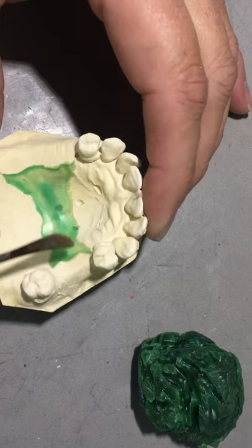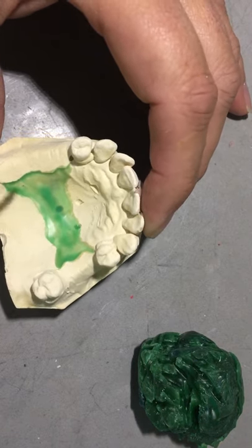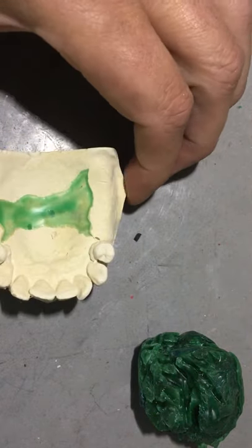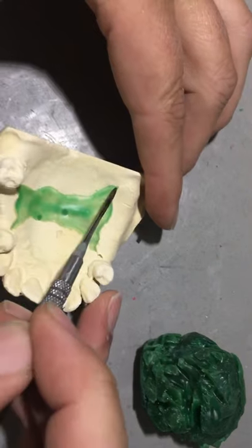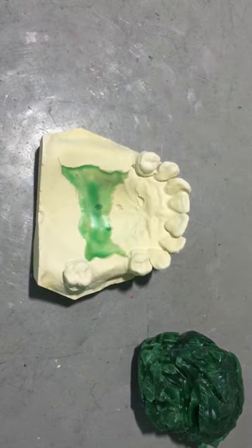You can see down the center line it's a little thicker and very transparent until I get to the bead lines that are filled in. It's imperative that these bead lines are filled in so you don't have any bubbles, cracks, or imperfections.